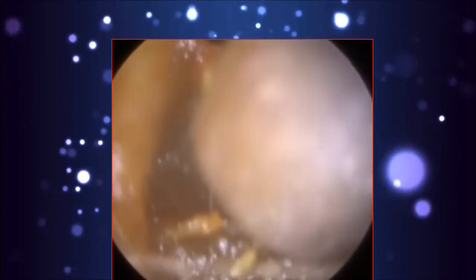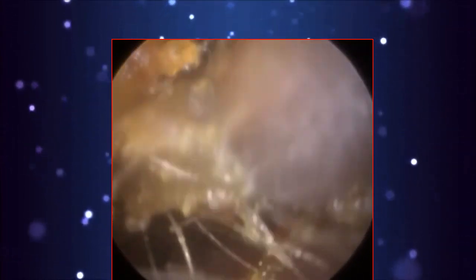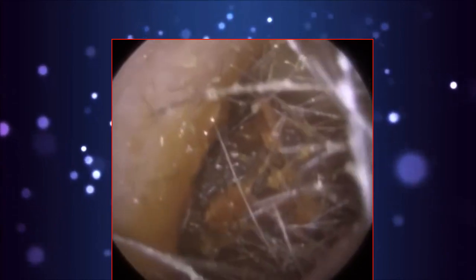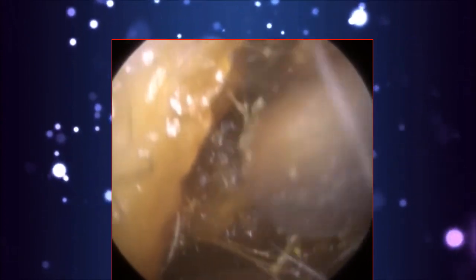Sometimes I actually put some drops in there, some olive oil drops, just because it binds it together, and it also prevents the suction probe from getting blocked. I think I managed actually on this occasion to remove it without using any drops. So although it was sticky and glutinous, it still did hold its shape somewhat, and it wasn't blocking the suction probe on a regular basis. So I just continued.